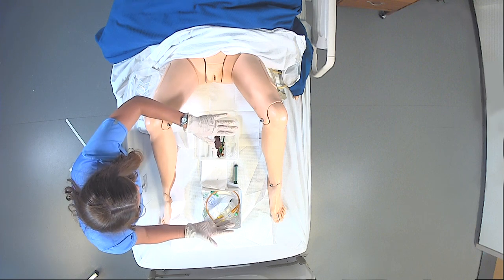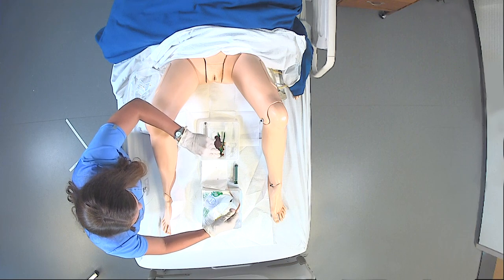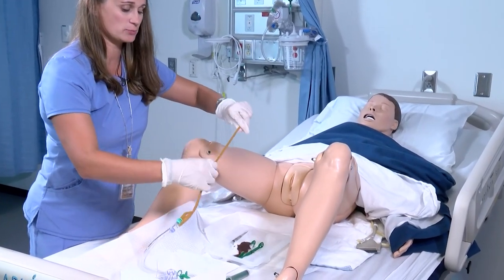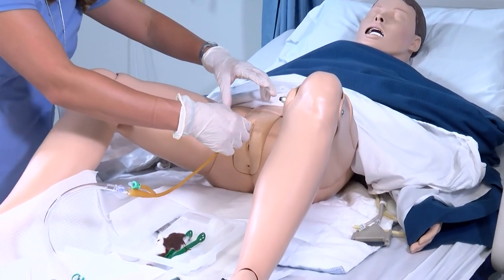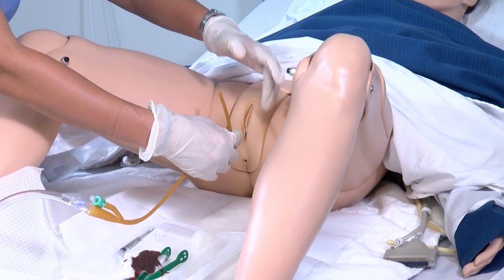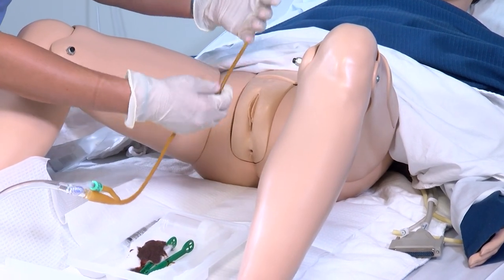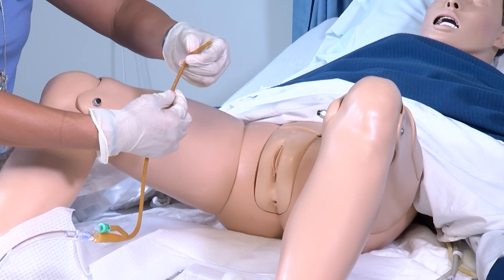As best practice, when you're grabbing the Foley, you want to be close to the end of the catheter, because if you're trying to place it in a patient without control, it can flop around and inadvertently touch the sides of the patient's leg, peri area, or hair — and that would contaminate the Foley completely and you would have to start over with a new kit.